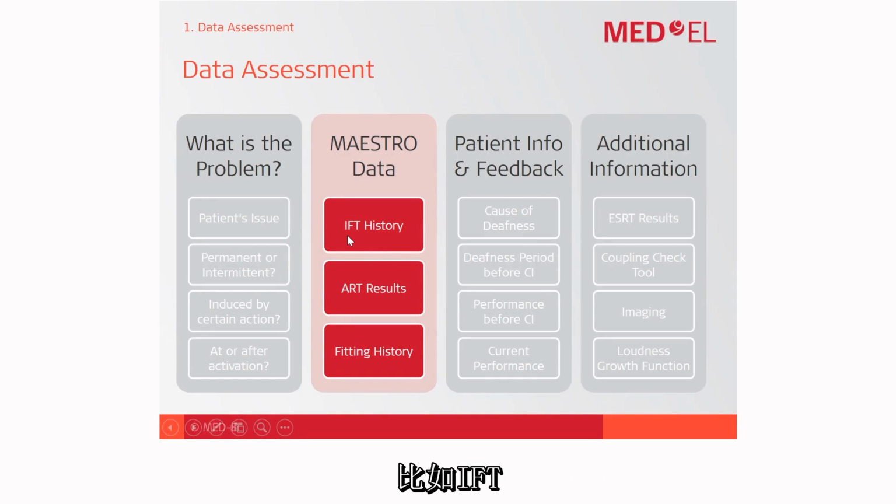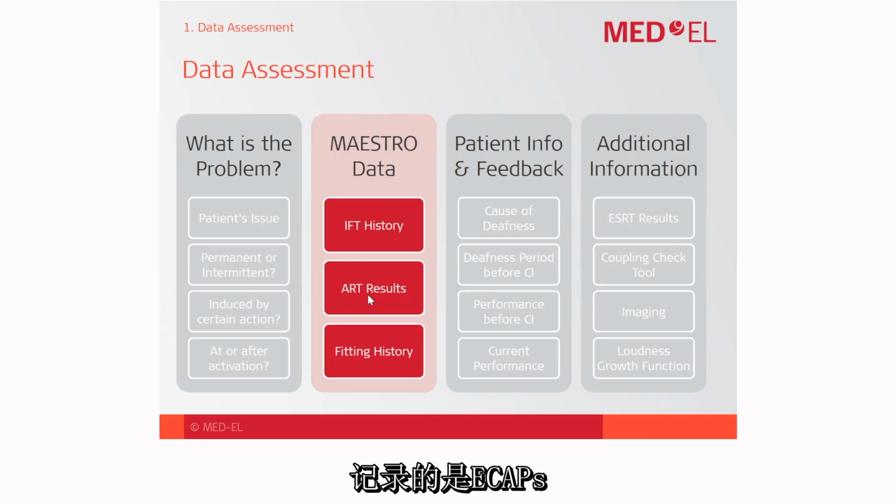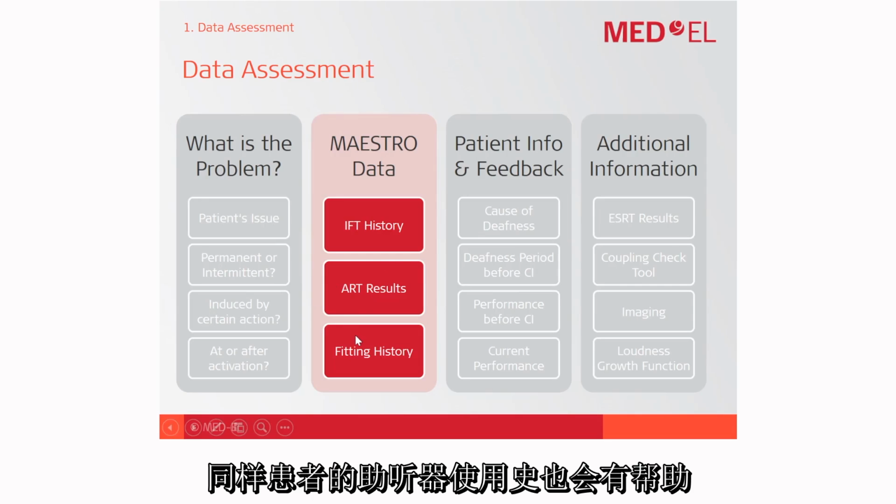One of them is IFT. IFT stands for impedance and field telemetry. ART captures the potentials of the peripheral auditory nerve, so it records ECAPs, and also the fitting history is helpful.